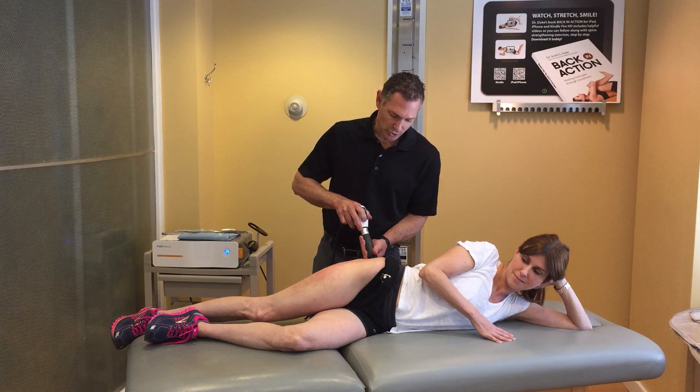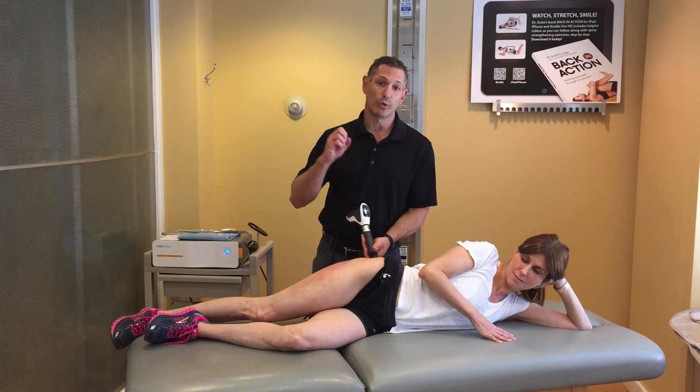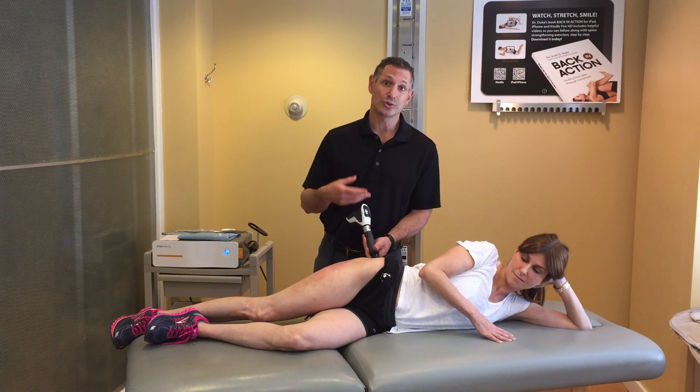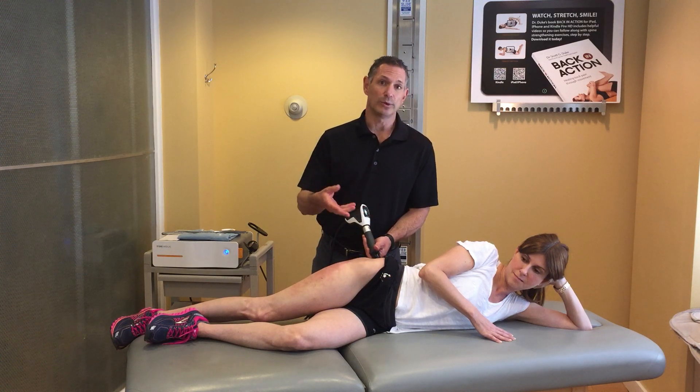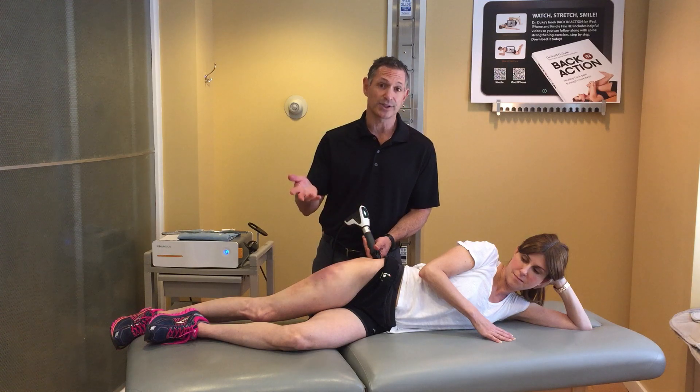Because I use Graston, active release, heat in the area, I find exactly where I want to apply the pressure wave, and as a result the pressure wave will burst the scar tissue. It will create angiogenesis — new blood vessels will form — and then the cells become very permeable, which means that through osmosis they start to collect collagen and new tissue begins to build. Essentially, it's like it restarts the healing process.